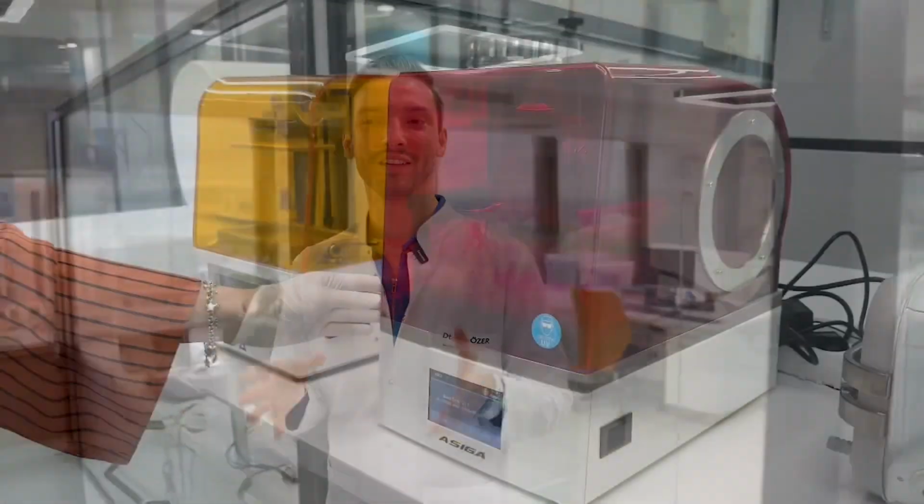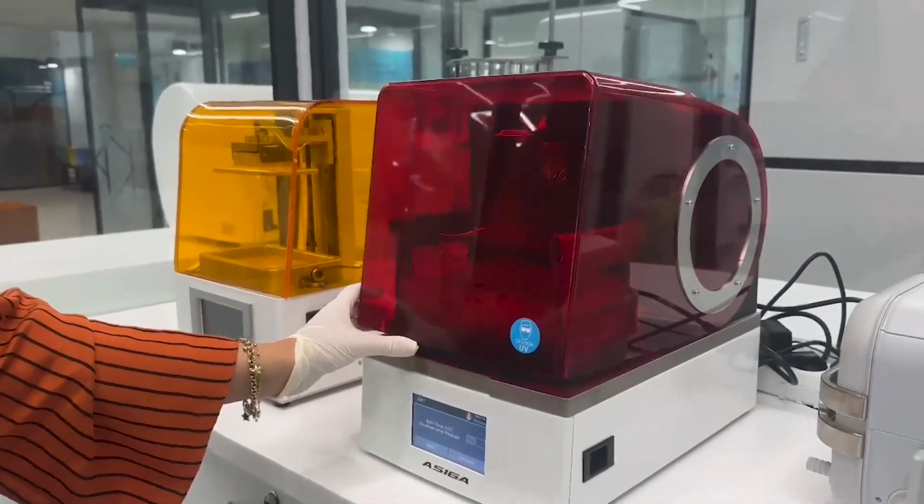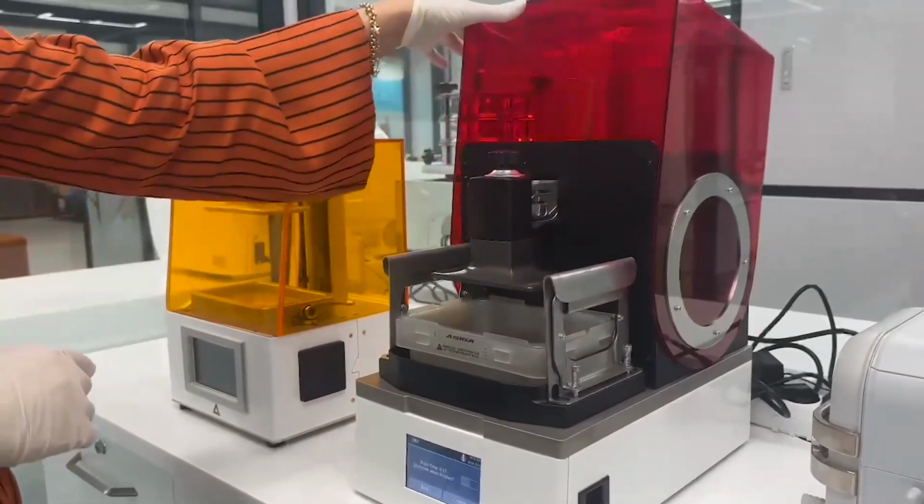Today I would like to talk about 3D printers. It is based on printing resin materials by adding layer by layer. 3D printers, which have been introduced to dentistry practice in recent years and are also used in our faculty, are devices that are frequently used in several areas of dentistry, such as temporary restorations, permanent restorations, removable prosthesis, night guards, aligners, surgical planning models, implant guides.